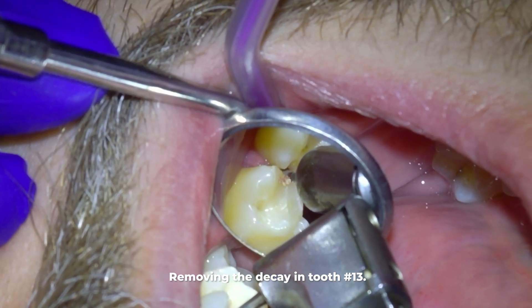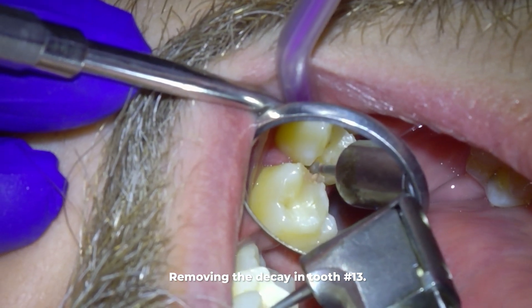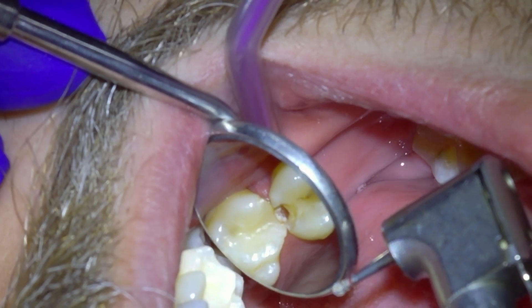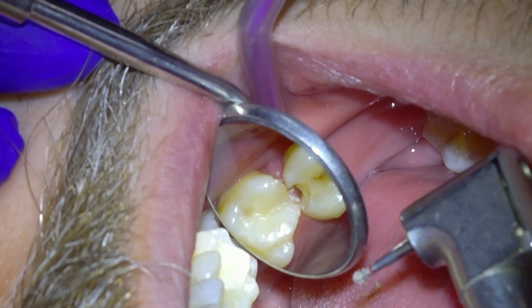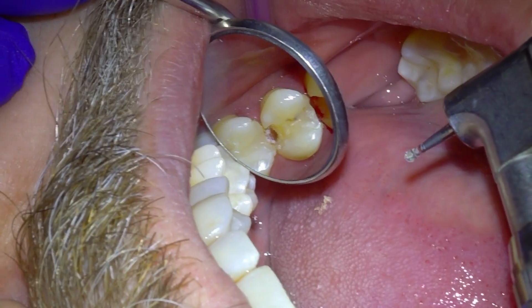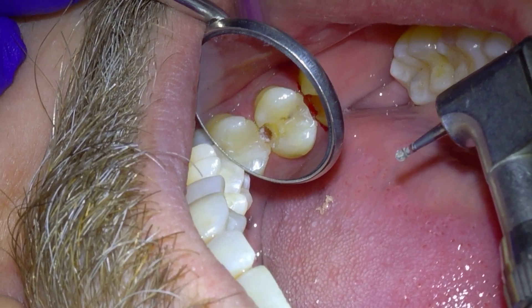In case you're wondering, I'm doing a lot of this for demonstration purposes. Normally I would have removed more of that decay with the high speed handpiece, but I wanted you to see what it looks like removing decay with the slow speed drill because it does come out with this mushy consistency — you wouldn't have been able to see that with the high speed. So this is what full-on decay looks like when it's being removed by the slow speed handpiece.